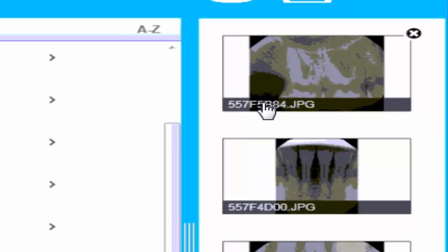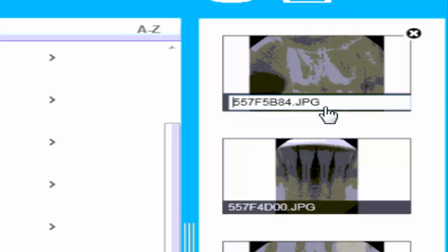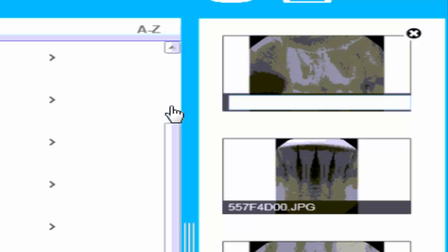It's always going to give you just a generic number and a .JPEG extension, so feel free to change the names of these images just by clicking on it, deleting this, and changing it to a tooth number or patient name, or whatever you want to change it to.